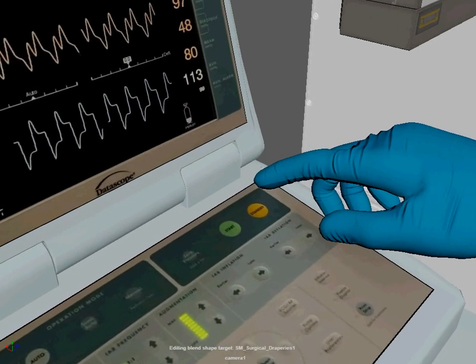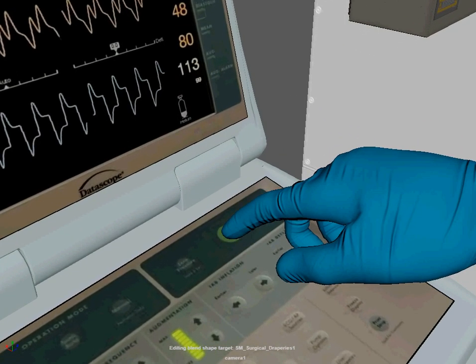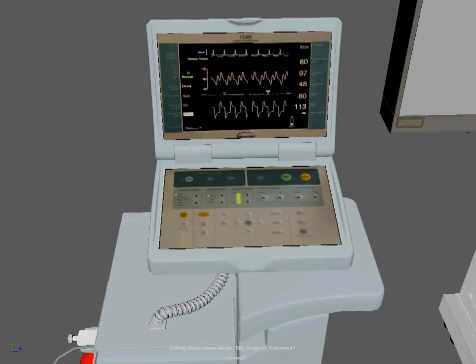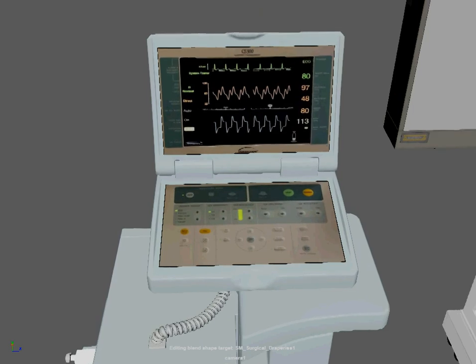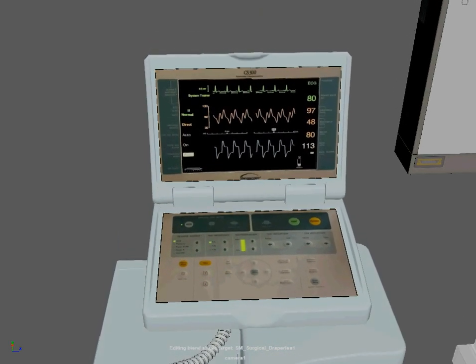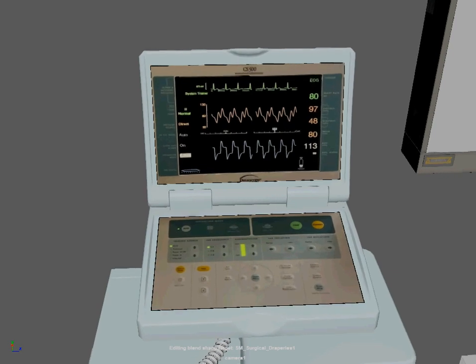Then we can press the start button, after which the system automatically purges and fills the balloon catheter. It automatically performs an individual calibration. It automatically selects the most appropriate lead and trigger, and it automatically sets inflation and deflation timing.